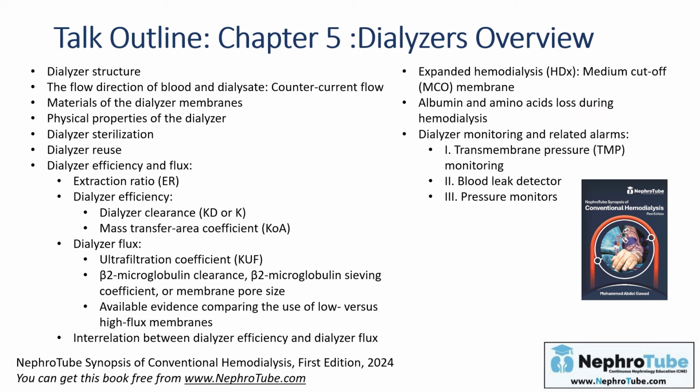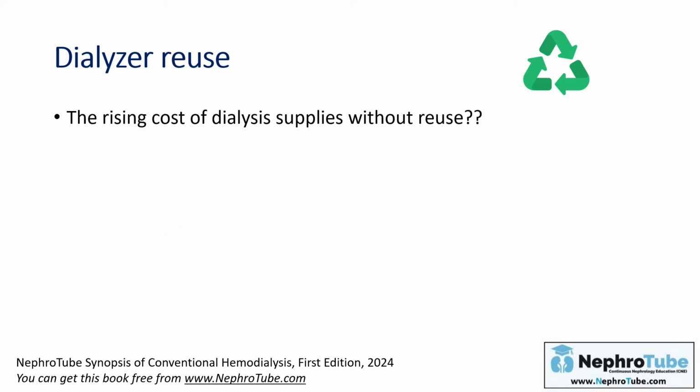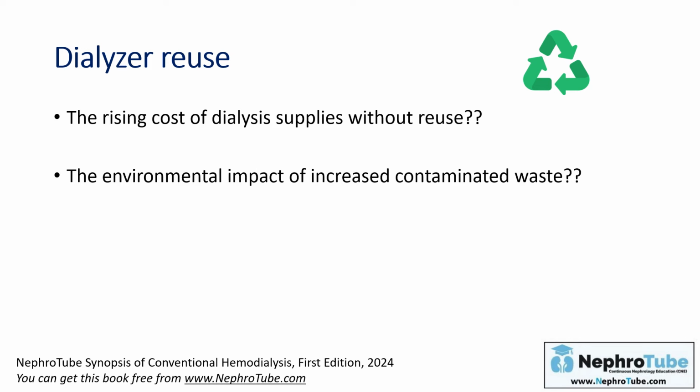The next point related to the dialyzers overview is dialyzer reuse. We all know that there is a rising cost of dialysis supplies in the absence of reuse. And also we know, and we mentioned in the lecture where we were talking about the dialysis water unit, about green nephrology and the impact of dialysis on the environment.